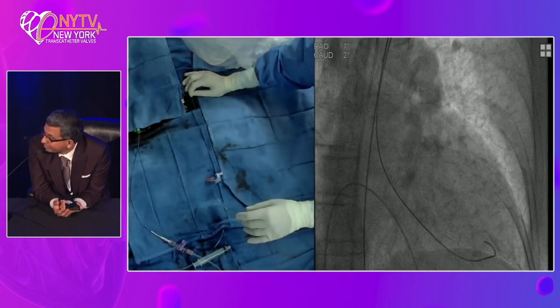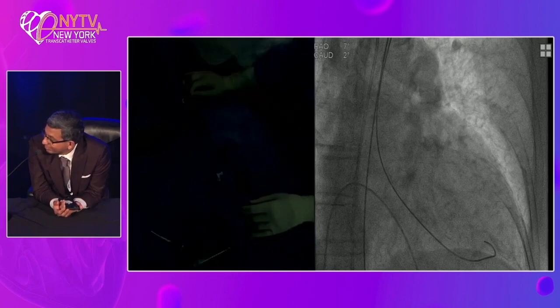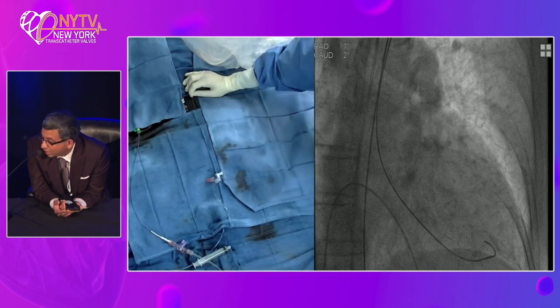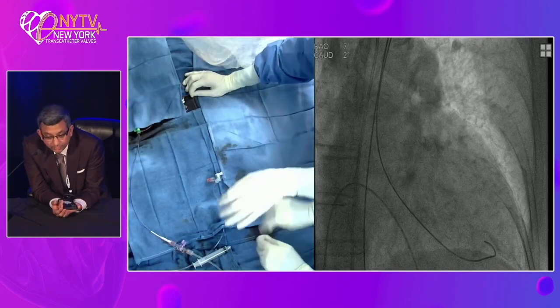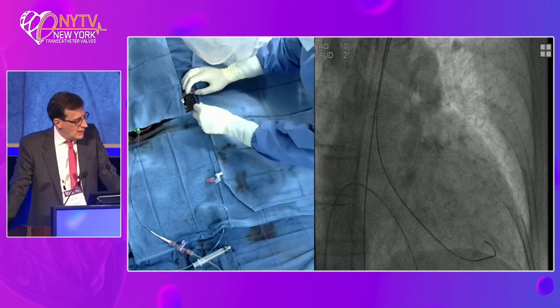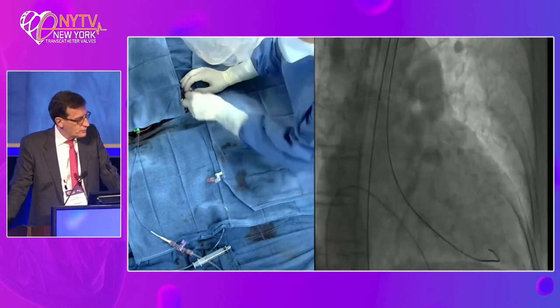Although you could argue that the aorta calcification is a bigger risk, if not more so, based on the early data on hits. Right, but the distal calcification, beyond the arch, yes, the arch is calcific, but beyond where you see it, it's there further too, I'm sure.